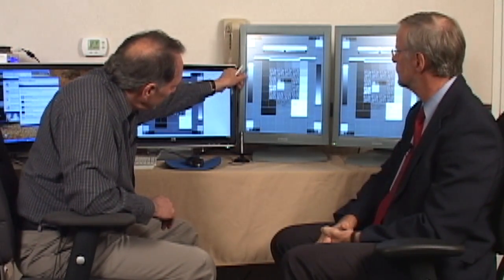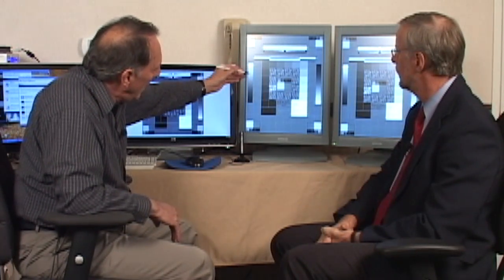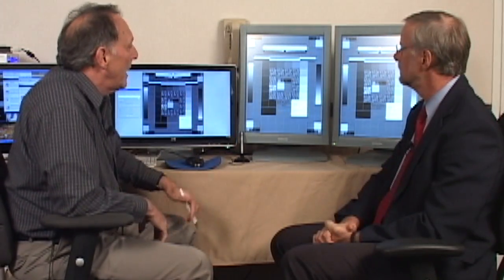And what you're looking for there is a very smooth transition of grayscales. You do not want to see what looks like a sharp edge, like there's a large jump in luminance difference. It should look like a very nice smooth transition. If you see a line, that would be a large difference between 2 areas. That would look like a contour line, say in the upper part of a lung field. So if you see contour lines in a lung field and you don't think it's actually there, it's not an anatomical feature, the way to check is to throw this test pattern up and look at your grayscale ramp and just see how well that looks. If it's not smooth, then you've got a calibration problem.